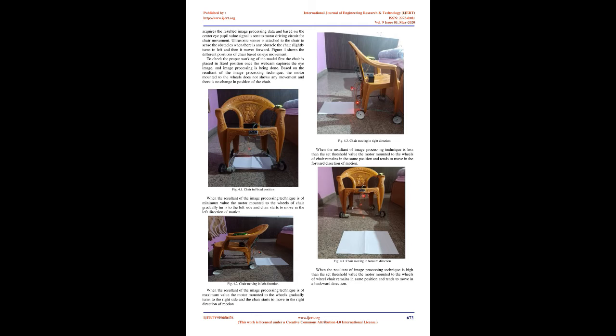E. Hough transform. The Circle Hough transform method is used for drawing a circle on the eye pupil, which is a result of edge detection. Images are continuously captured according to the eye movements. The Circle Hough transform detects the eye pupil movement and draws the circle. F. Eye tracking. For tracking the movement of the eye, a projection function algorithm is used, where a coordinate system points to the center point location of the eye. For representation of movement of the eye in right or left direction and to detect average points of location of the eye pupil, 2 directional graphs based on horizontal and vertical axes are implemented.